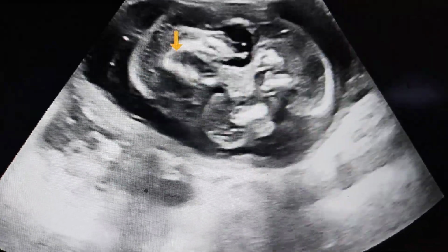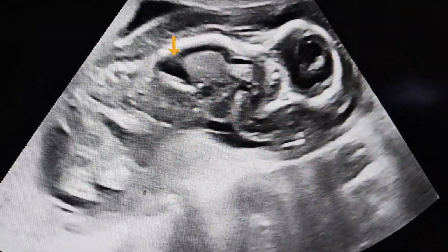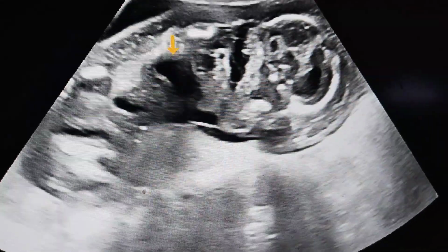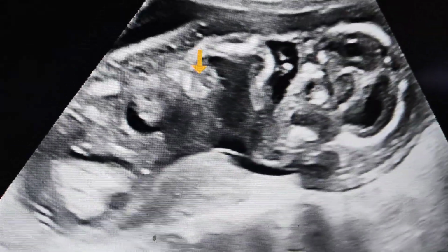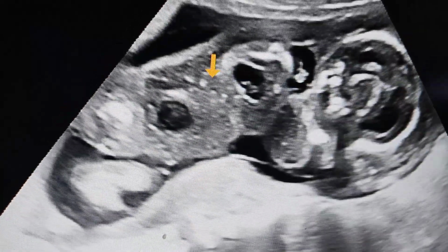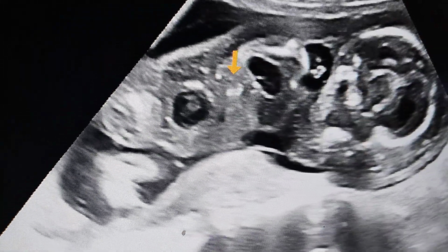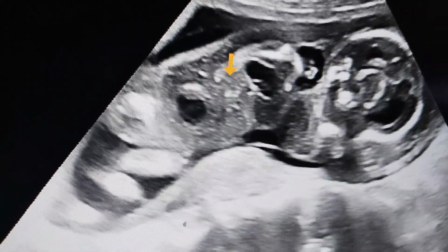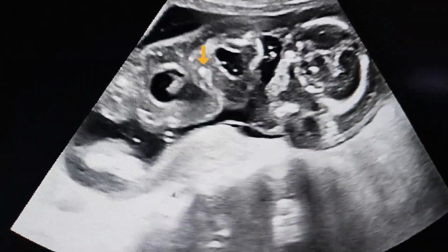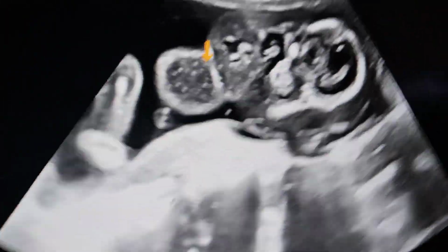So we have seen that this fetus is having cystic hygroma, due to which the fetus develops the subcutaneous edema, then ascites, and then the effusion. So whenever you come across hydrops fetalis, we must see the four things.